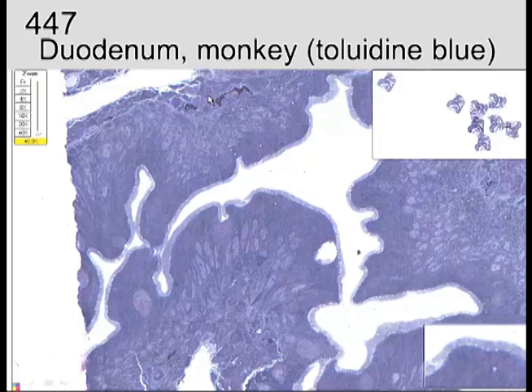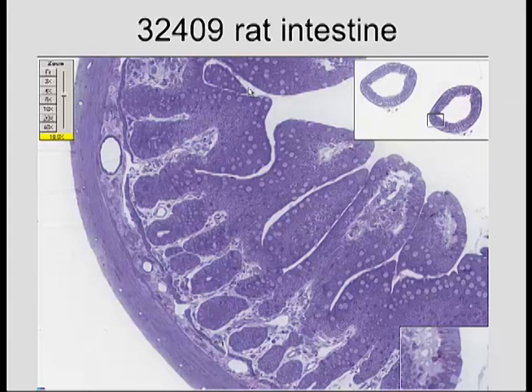Now in the connective tissue here, we can see the central lacteal, which is what we saw before, which is the lymphatic, drains the lipid that you absorb in your gut. And here we see some mast cells. These are mast cells, a certain type of white blood cell.